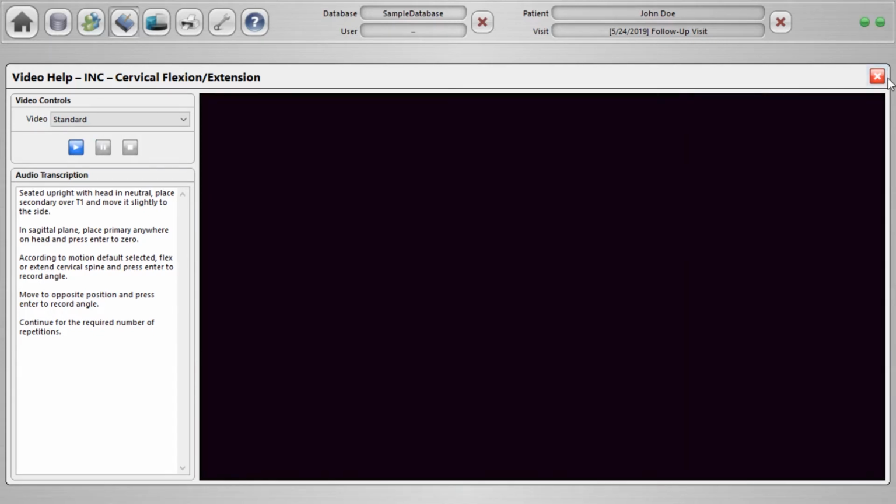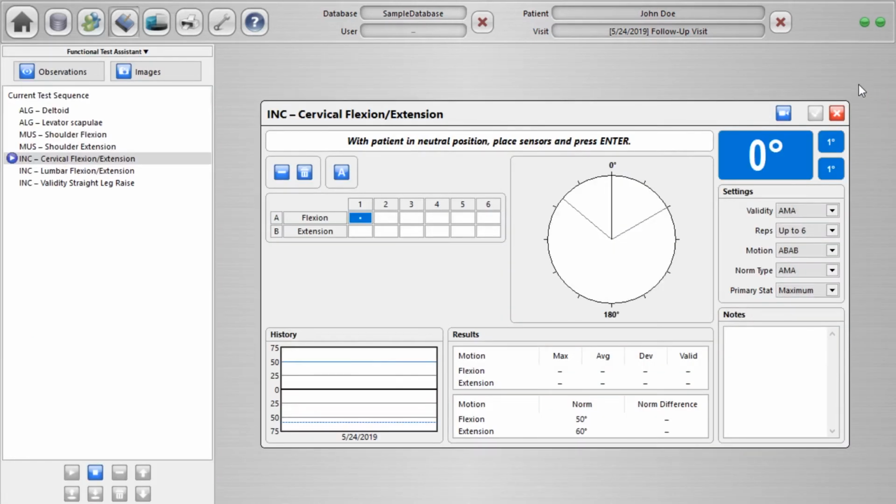All right. So you may have seen an inclinometer test performed before, but of course there's two of these inclinometers. There's a whole method that the American Medical Association defines about how to capture that data. And that, I think, really highlights the idea of using measurement tools to perform those kinds of tests as opposed to using visual inspection. Visual inspection is tricky, especially with spine range of motion, because, for example, spine motion is compound motion.